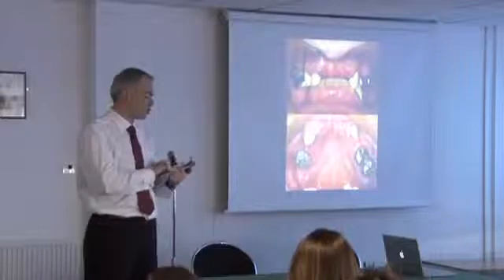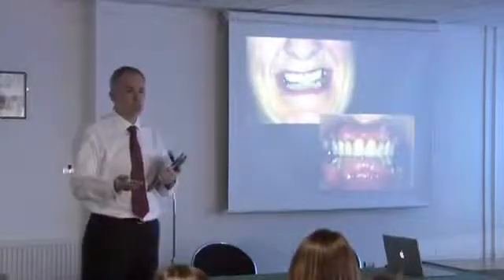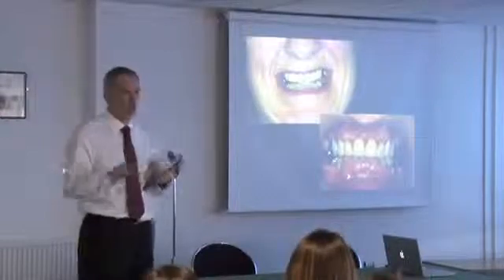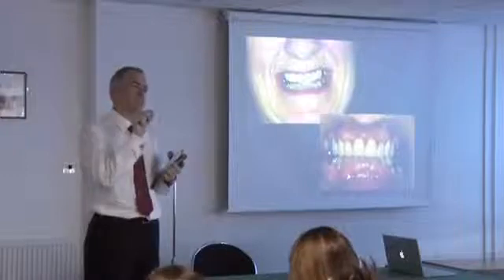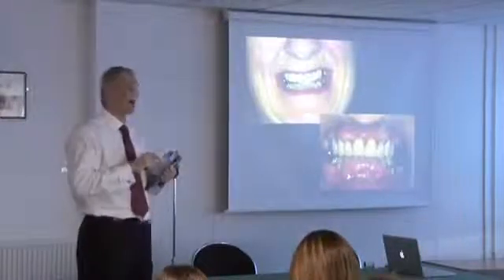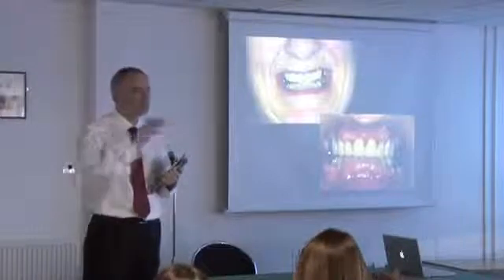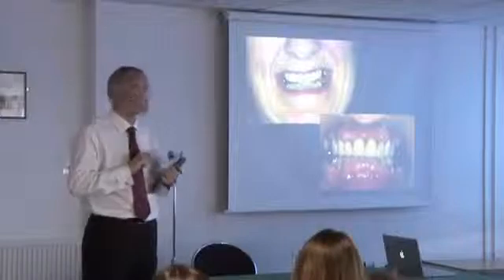So what I would do first of all is do a wax up. You could do the wax up chairside if you're that way inclined, you want to be artistic about it, or you get the technicians to do it. So it's just a wax setup. Ignore the lower teeth. I'm not interested in the occlusion. The patient's come in because she wants the aesthetic, so let's give her an aesthetic situation she likes, bring the teeth together as I've done in the lower, and see where the problems are. Because that's when the problems can be highlighted. You can't tell the problems from before. You've got an idea, but they're not really there. Now they're there, because that's what she wants, she likes, and that's what we have to achieve.